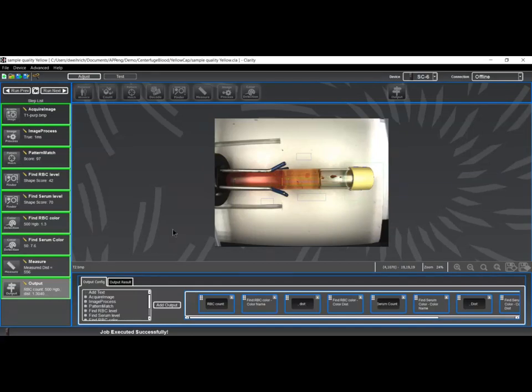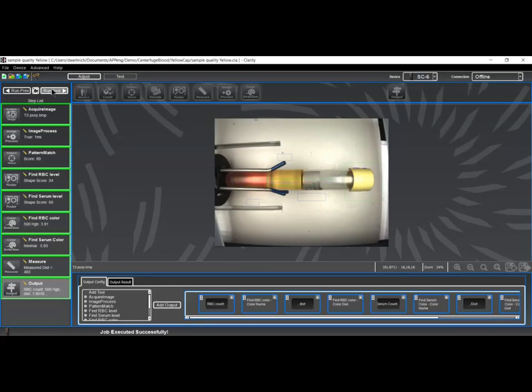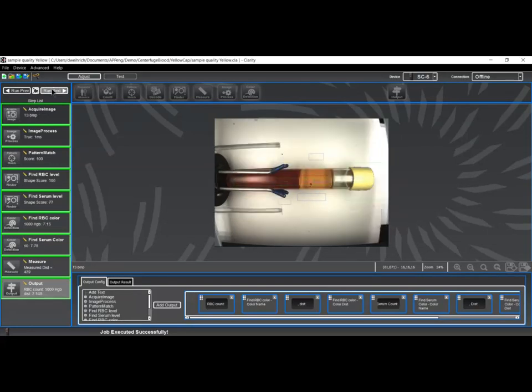One remaining aspect of validating the usability of a centrifuge blood sample is to find if there are any impurities in the serum area. This is a good example of showing that sometimes we can get blood clotting or some other foreign object in the serum area, which, if you were to try and pull a sample with a pipette or with a needle out of this area, you may pull in part or all of a clot, in which case that would throw the processing off by a large amount. You can see some of these samples have an issue and some of them do not have a problem.